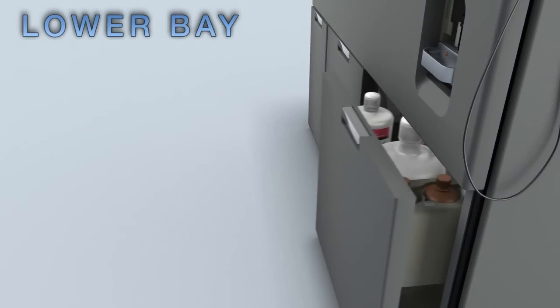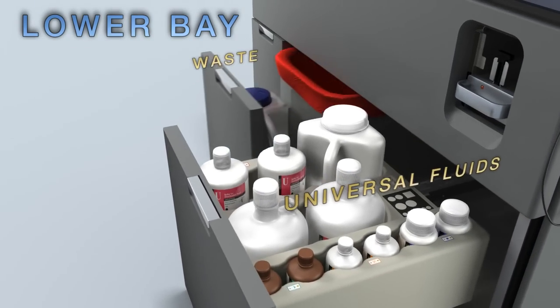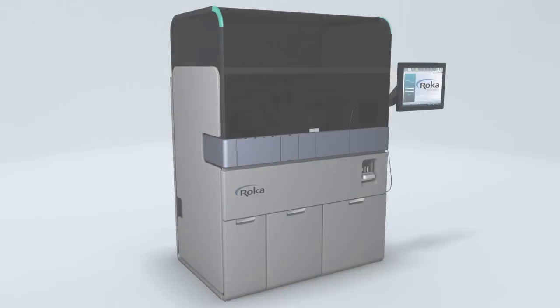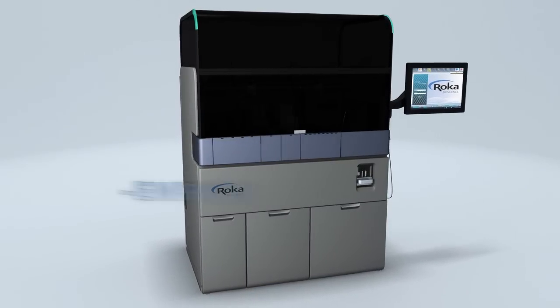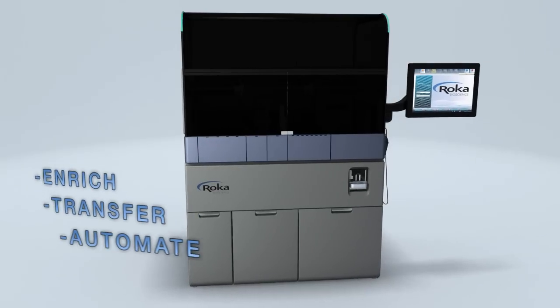The lower bay drawers house the universal fluids as well as the solid and liquid waste. The Roka process requires three simple steps: enrich, transfer, and automate.